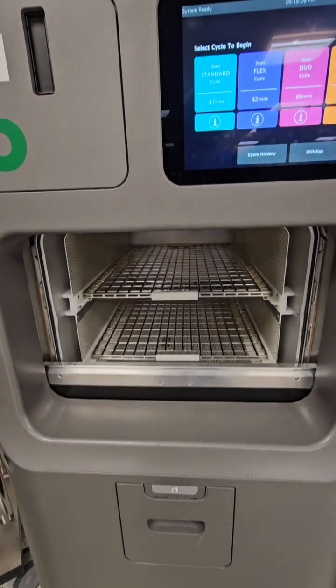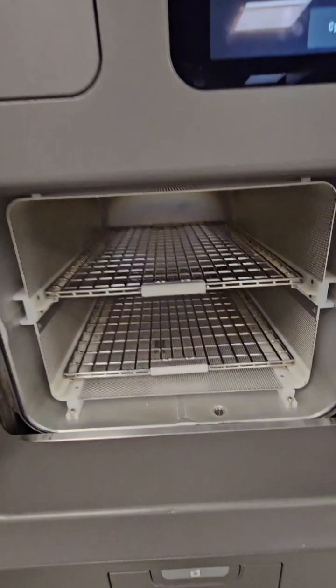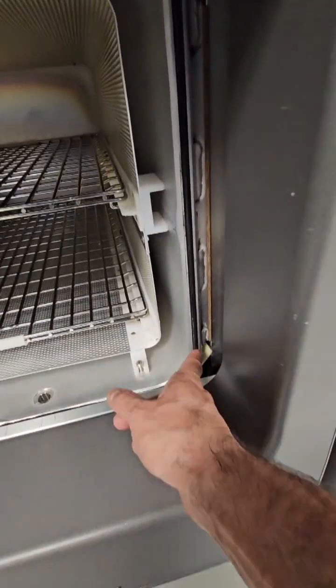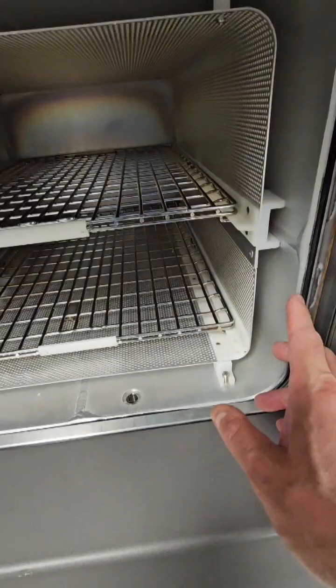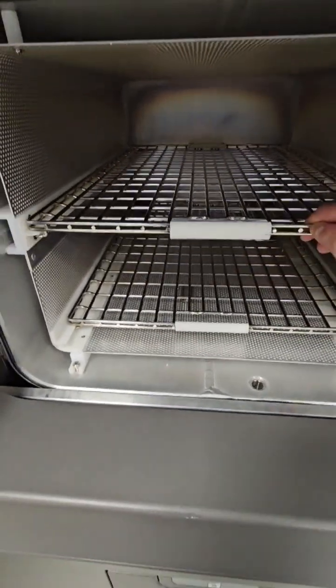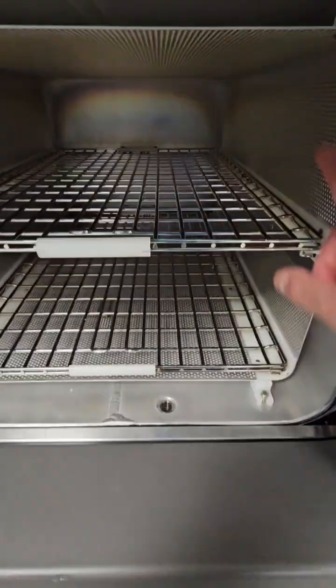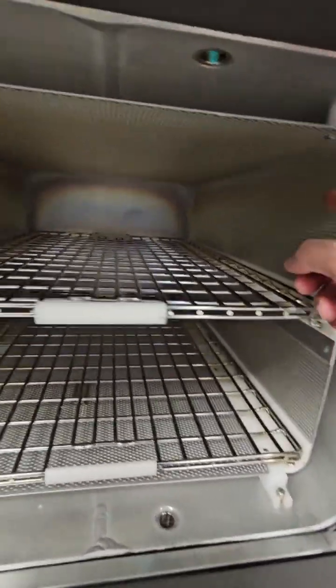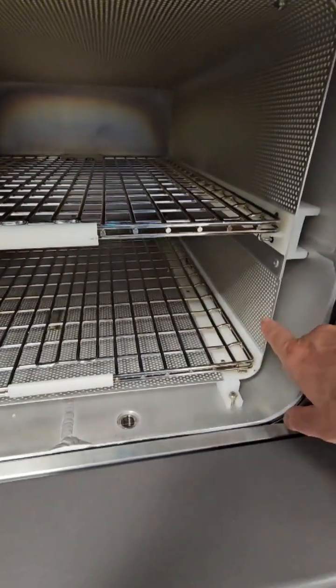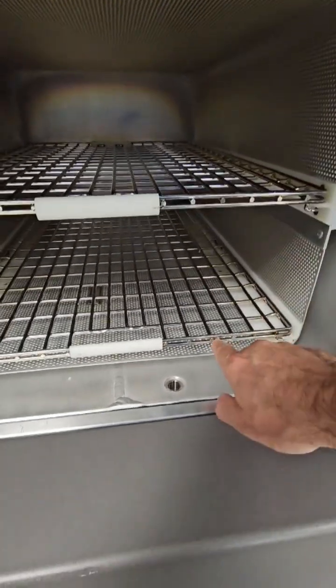Chamber door open. Let's take a look inside our chamber. Make sure the gasket is intact and clean, the chamber walls don't have any adhesive or anything blocking them, the racks move in and out freely, and there's no adhesive or stickers on there. The chamber walls are designed the way they are for a specific reason.